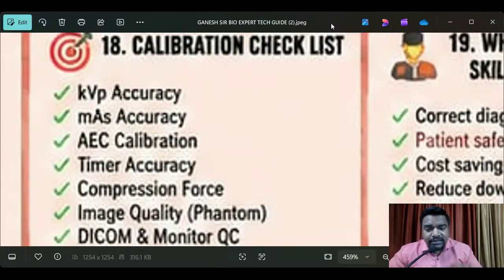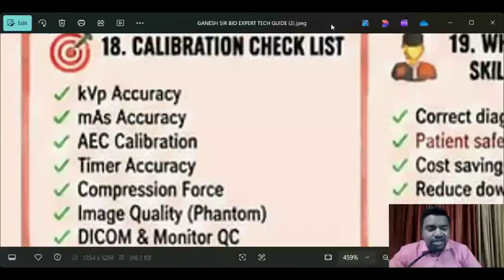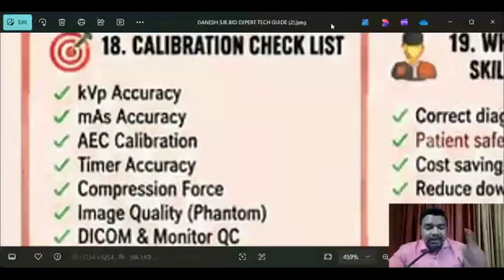Then we have to clean up the equipment, check everything, and make it working condition. After resolving the issues, only then do we apply the PMS. If it is in not working condition, then PMS is also not applicable. You have to keep in your mind what I'm saying here. And PMS is what I have given: cleaning, checking, replacing and making it working condition.